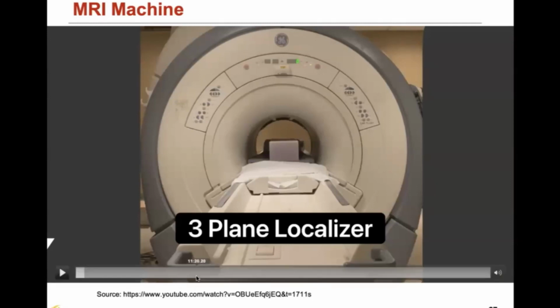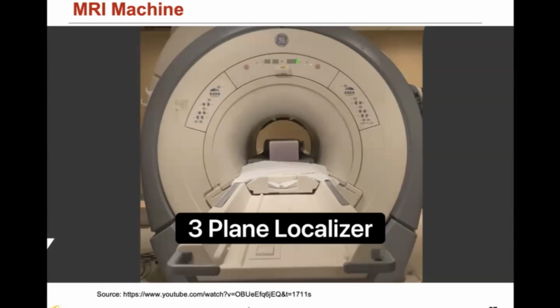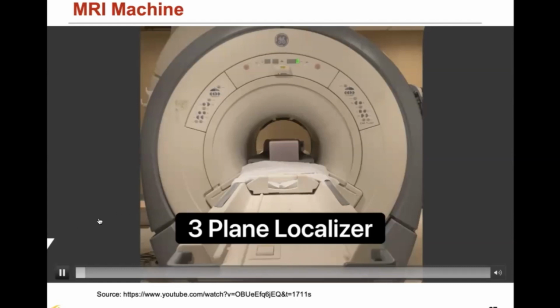So actually, there are a couple of sources that can make this kind of noise. First of all, you have the cooling component. The cooling is always running to keep the magnet cool. So that's one source of the noise coming from the MRI scanner. And also you have these gradient coils. They interact with the main magnetic field, and that will cause the coil vibration. So you hear some of the knocking sound. Okay. But yeah, you can actually hear a different sound in this video.